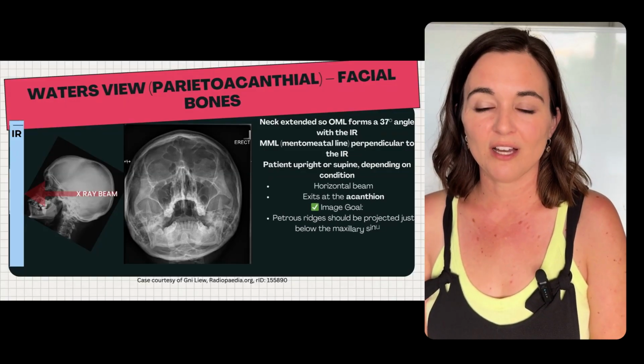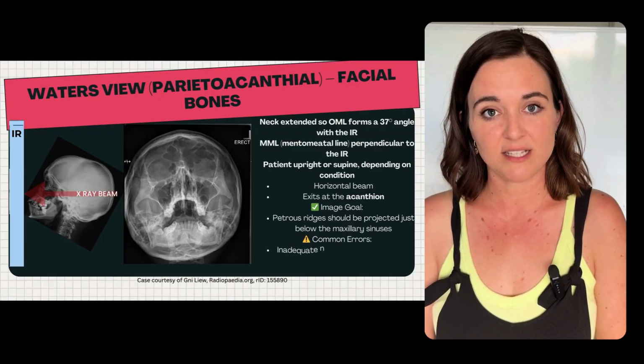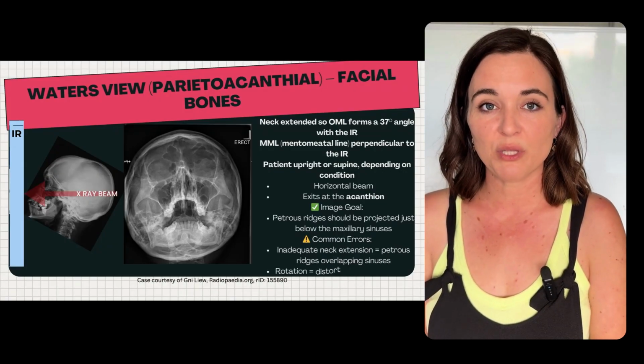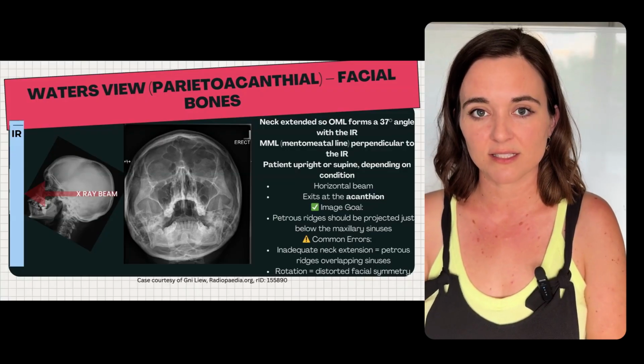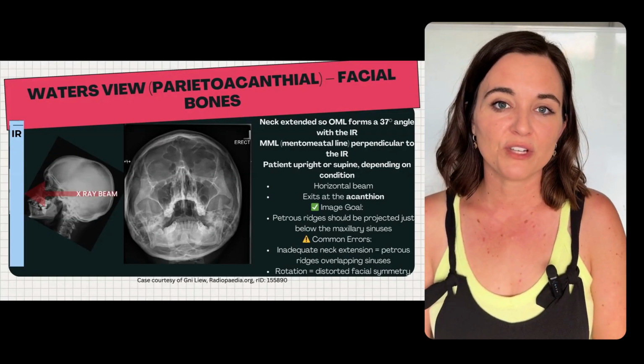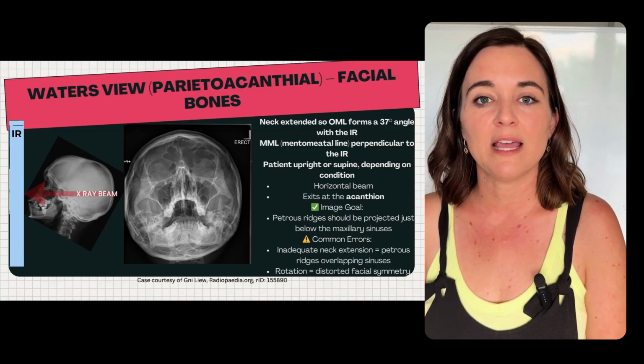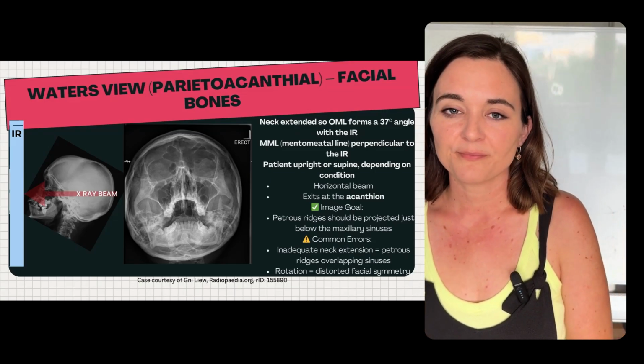Our goal here is a clear view of the maxillary sinuses and orbits. Petrous ridges should lie just below the floor of the maxillary sinuses. This is most frequently used for mid-face trauma, such as orbital floor and maxilla fractures.